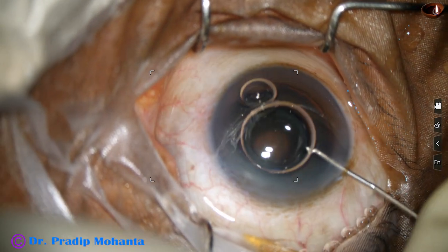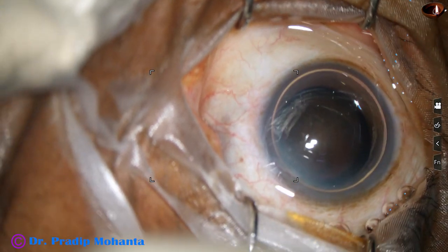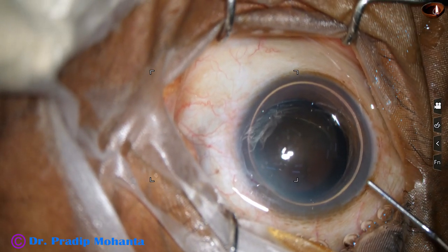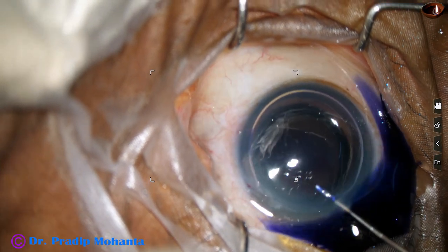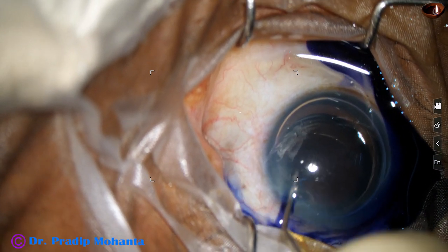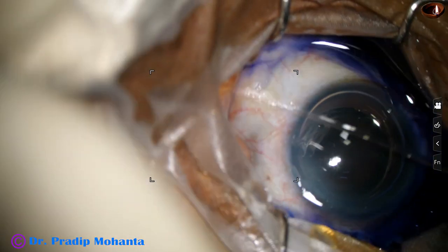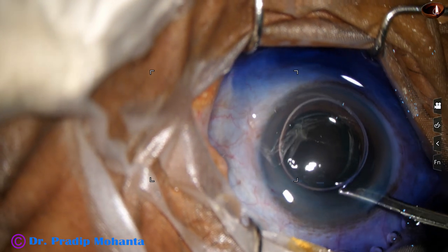An air bubble is injected to fill up the anterior chamber. The anterior capsule of this hard cataract is stained with trypan blue dye underneath this air bubble. This is a bit of adrenaline. And now the dye is washed out.